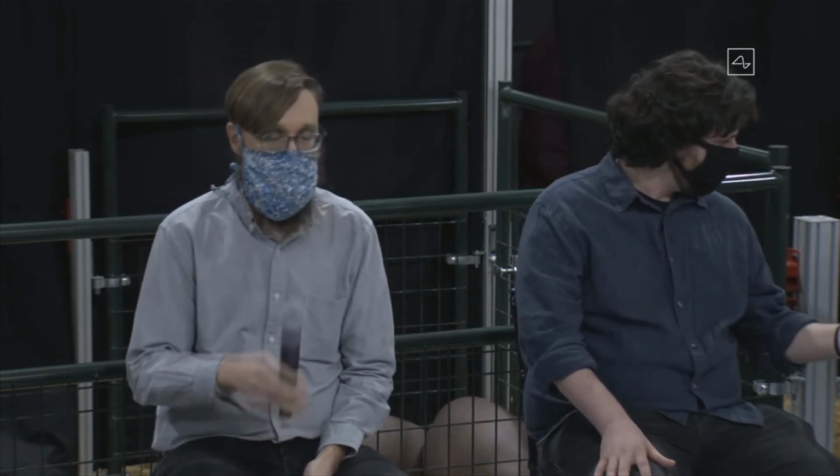Wow. Yeah, following up on stimulation, one of the things our device can do is simultaneously read and write on every channel, stimulate and record. That's both a more challenging problem than it may seem at first, but also incredibly exciting, the vistas that it opens up. It's really the whole game in terms of interfacing with the nervous system, and I'm very excited to use that.